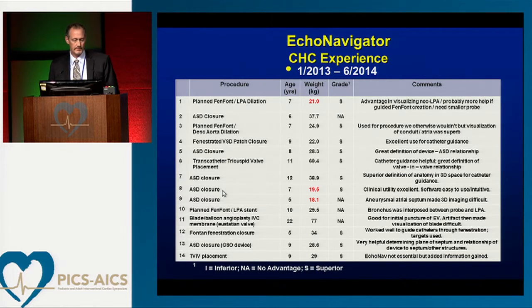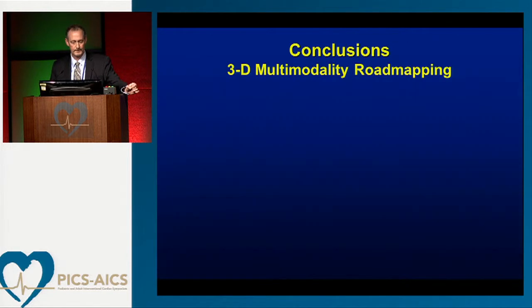There were 3 Fontan fenestrations that we were planning to create in patients with PLE. We got into the lab and found out we had other things we could do rather than create the fenestration, but we did use it to guide those other interventions. And some of those turned out to be not advantageous through this. However, we are still learning from this technology, and we think for certain lesions it's going to be extremely helpful.